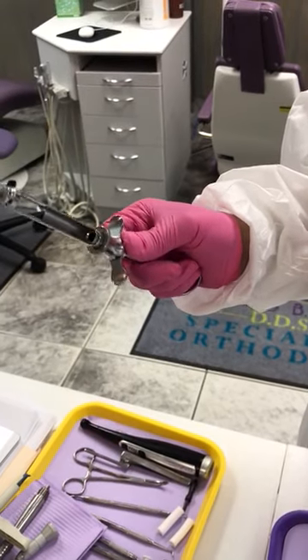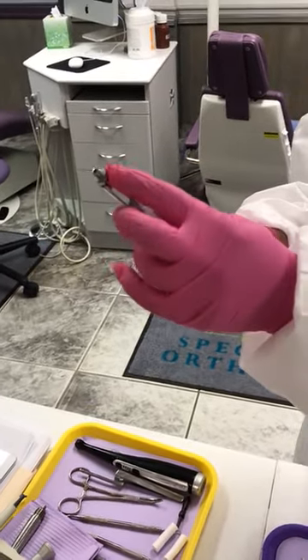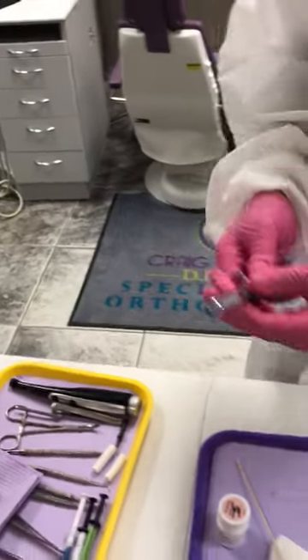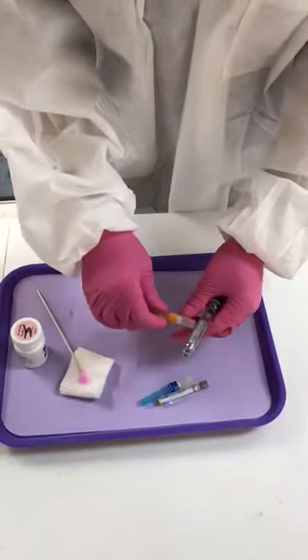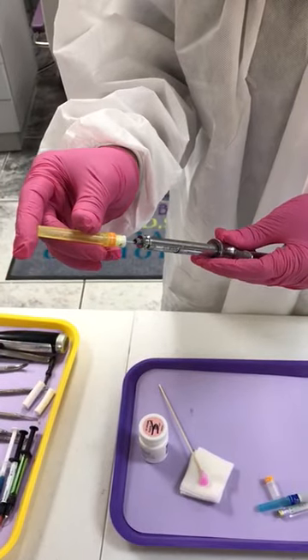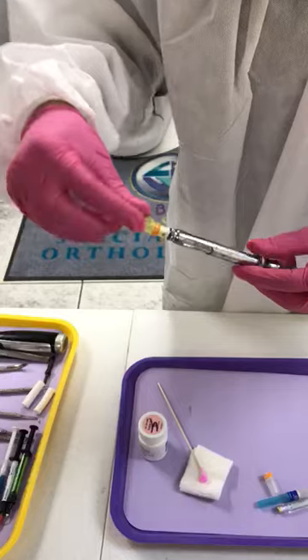I'm going to pull this back and drop the cartridge in. It's in there. Now I'm going to take the needle and place it. You have to be very careful because you don't want to stick yourself, so I'm going to place the needle and get it all tight.